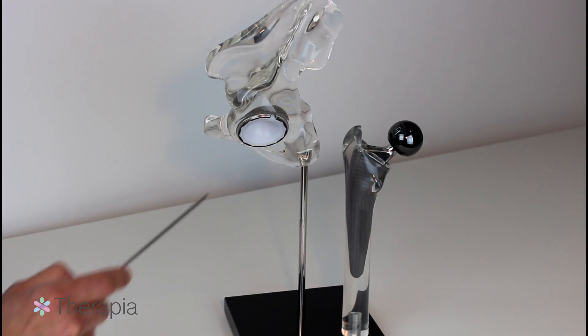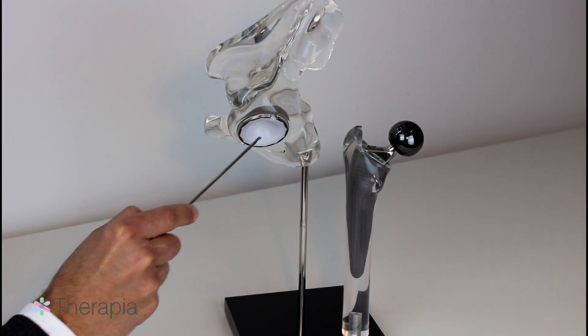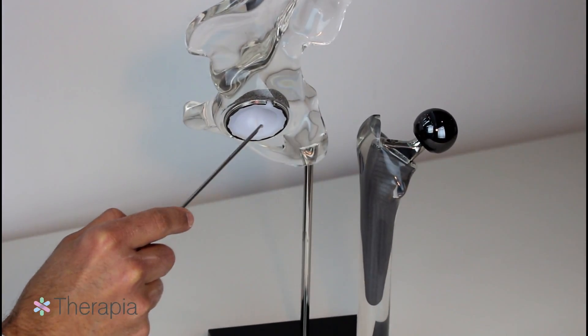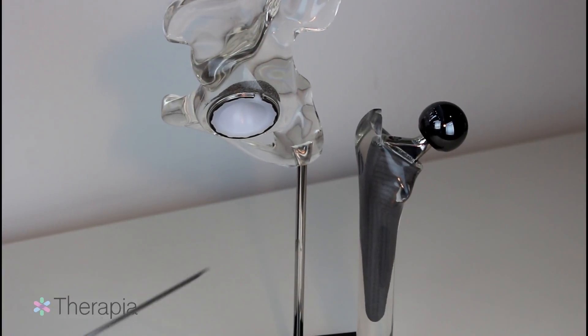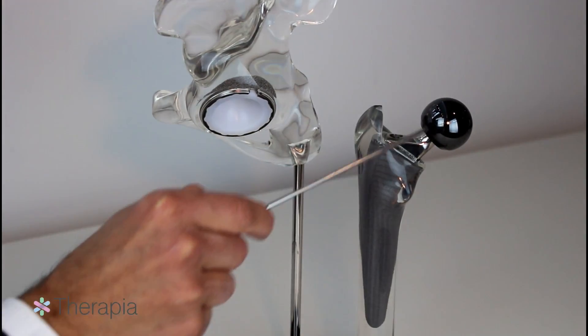The acetabular side has been replaced by a metal socket or metal cup, which is in turn lined by a plastic or polyethylene liner. The femoral side has been replaced by a metal prosthesis within the femoral canal as well as a prosthetic femoral head.